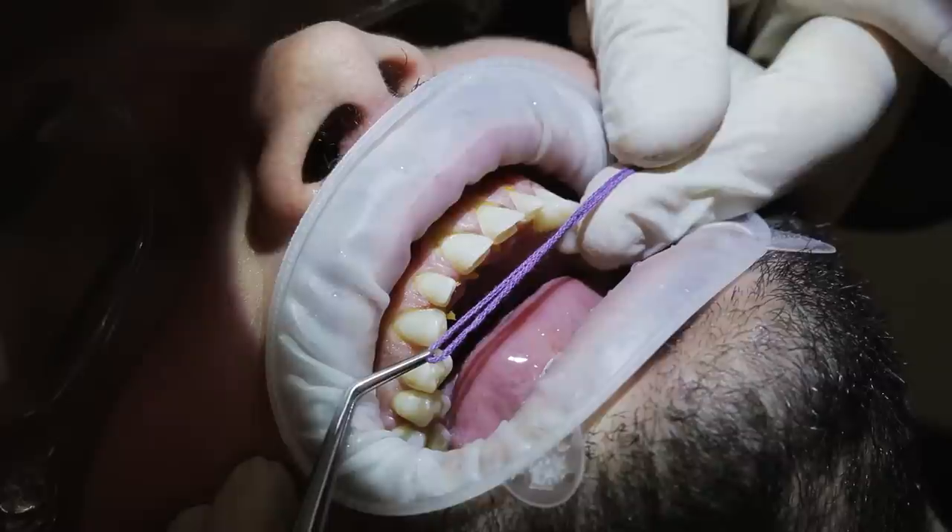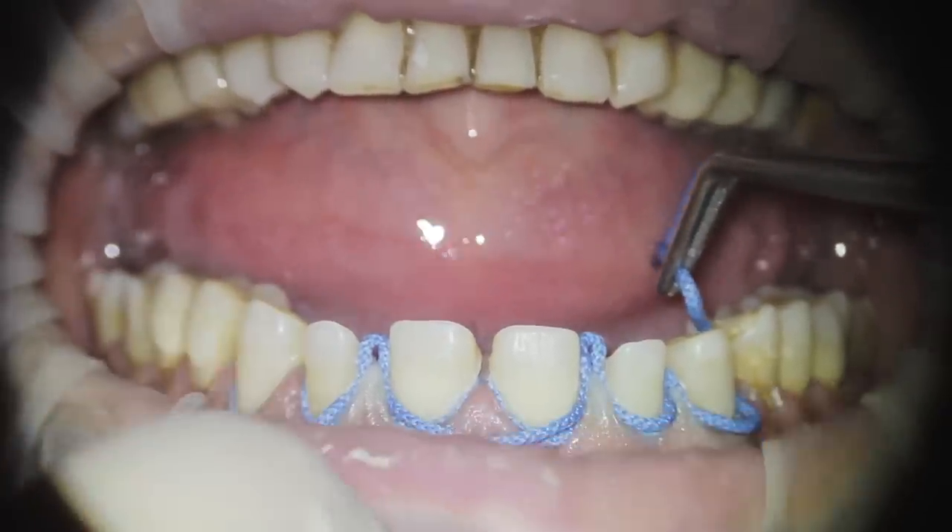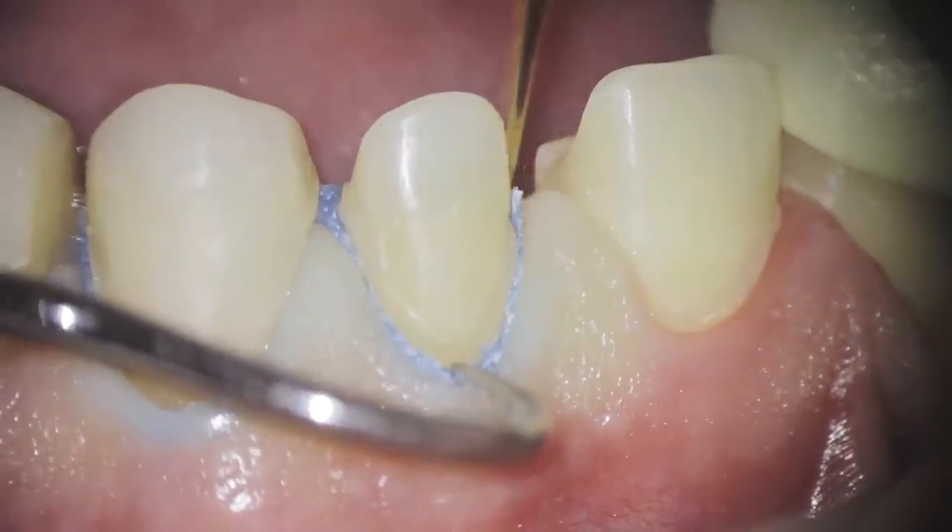If you put the cord inside and you can see more than 50% of the margin, proceed to the next step: placing the second cord. I like to use what's called selective double cord retraction, because you can place the second cord only where it's necessary. I don't like to stress the gingiva. The only word you must keep in mind during retraction cord insertion is: be very gentle. If you are gentle and kind to the tissues, they will reward you by staying at the same level as when you did your preparation — and that is key.